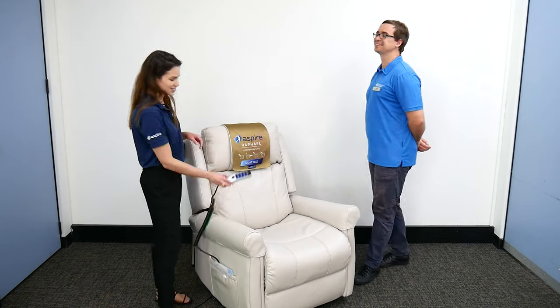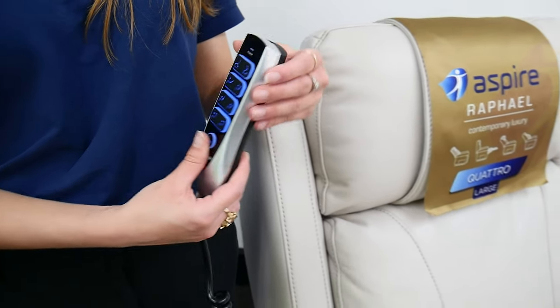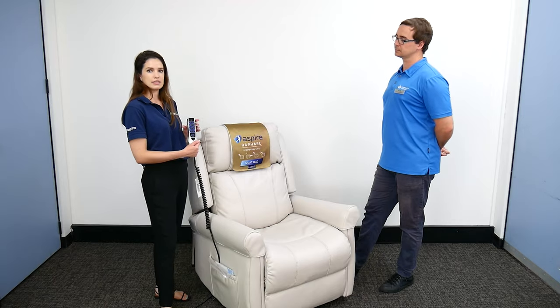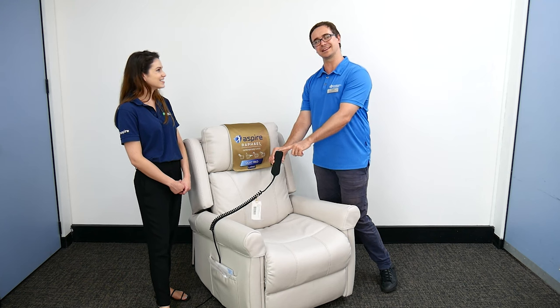There are also some features for tech-savvy users: a USB port on the top, and a backlit handset — so if it's dark or you've dropped it on the floor, it's easy to find.